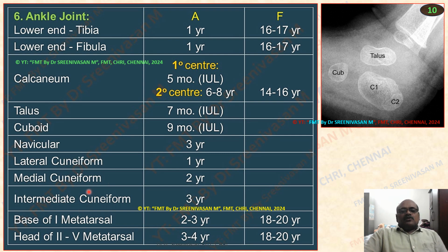Lastly, the intermediate cuneiform or middle cuneiform 3 years. 1, 2, 3 we can remember. So navicular also 3 years, intermediate cuneiform also 3 years. Then base of first metatarsal appearance 2 to 3 years. Heads of second to fifth metatarsals 3 to 4 years. Fusion 18 to 20 years.